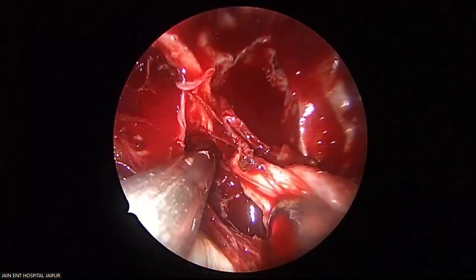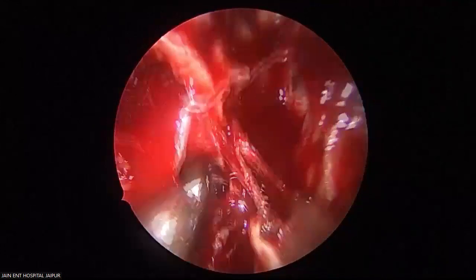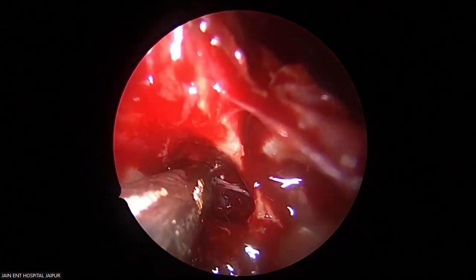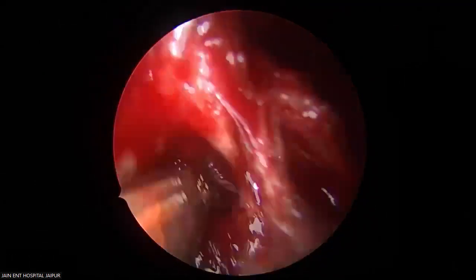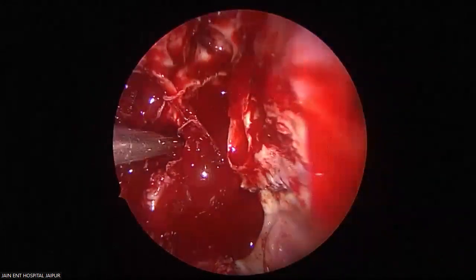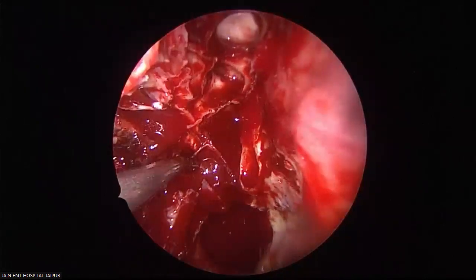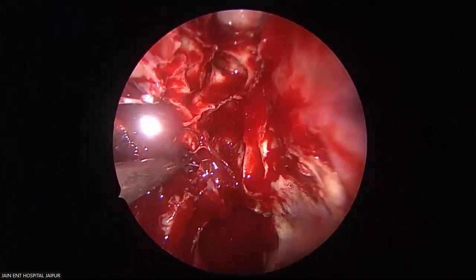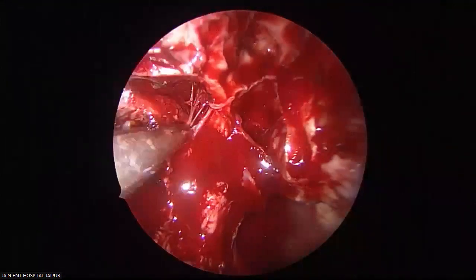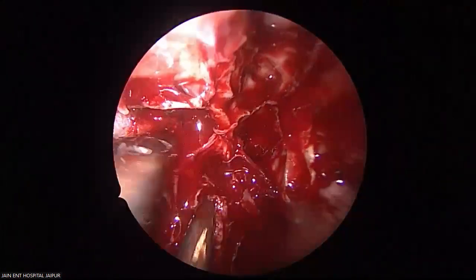Can you see this? Where this tumor has come from? Behind is the cavernous carotid where my suction is. See the space from where the tumor has come out. That is the superior orbital fissure and the component which was pressed into the cavernous sinus. See that? This venous oozing is expected. See my V2 laterally, that is going into the foramen rotundum. Somebody was asking, this is the foramen here.